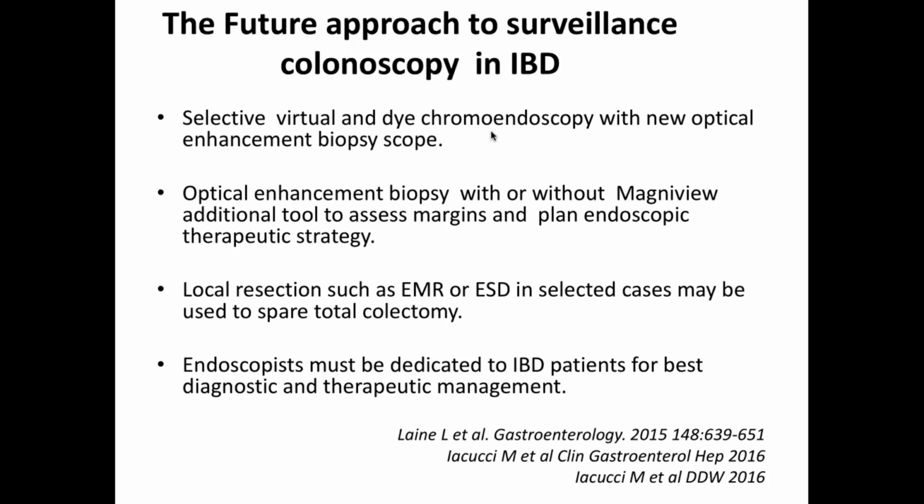So Marietta, the first question that's come in is specifically about virtual endoscopy. Are there specific training resources that you could recommend for newer endoscopists to enhance their skills to use it for diagnosis of IBD?